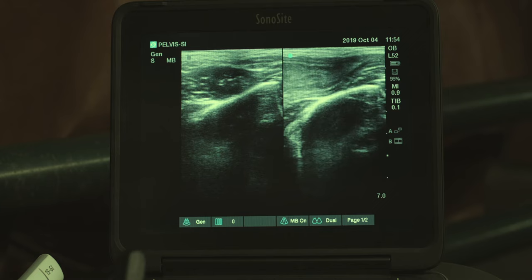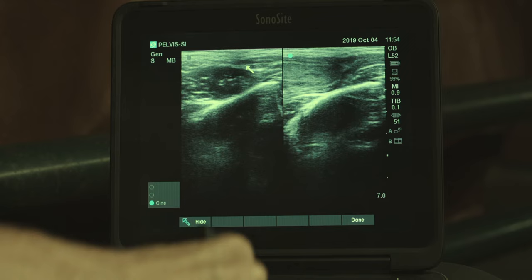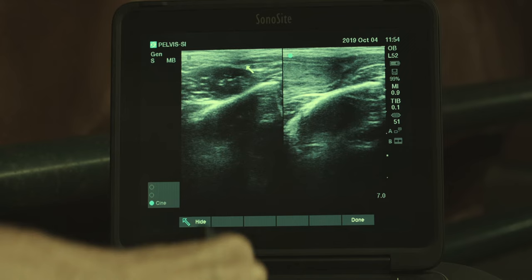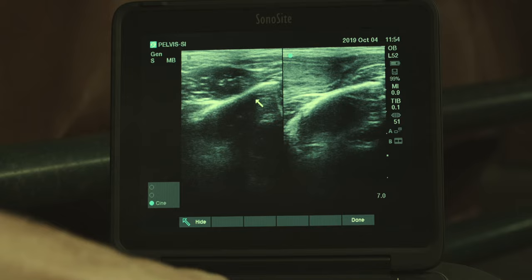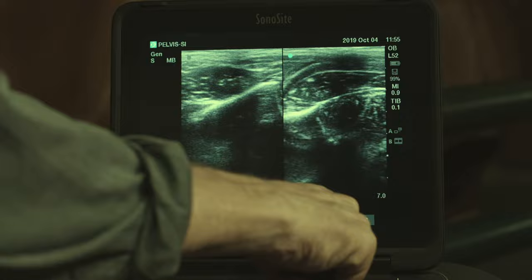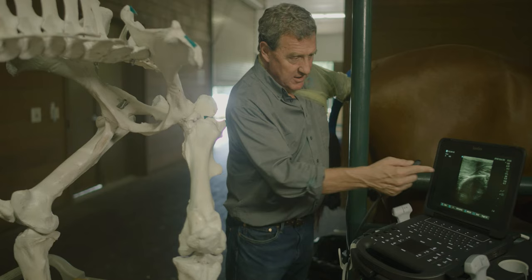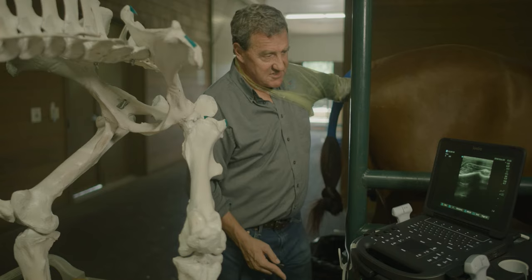We'll flip to the other side and do a duplicate image. Sometimes it has more of a curve to it, but again you're just looking at bone surfaces. Ultrasound is the most sensitive tool for bone surface detail. You're just looking for a contiguous bone surface here on the right and then here on the left. You can also go off dual for a second and just sweep the whole pubic edge to make sure you're not missing anything.